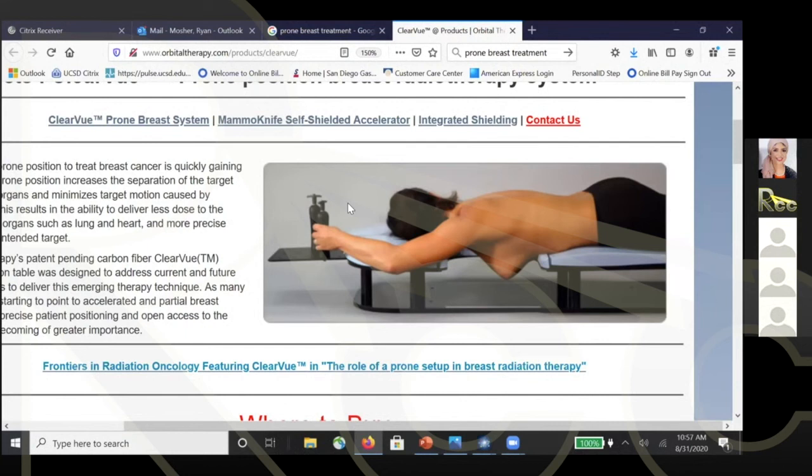Yes. Okay, so the prone patient would still be getting tattoos as well. They'd be getting one on the back and then also one on the side as well. So they'd be getting 2 tattoos. Lateral axillary line, I think, Ryan? Yes, lateral, correct. Lateral axillary line, yeah.